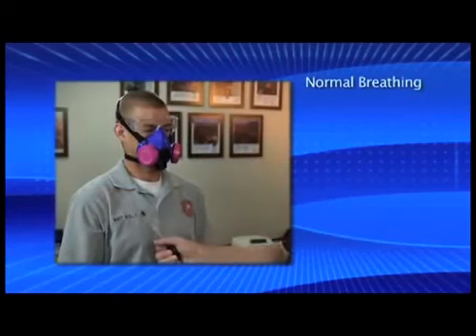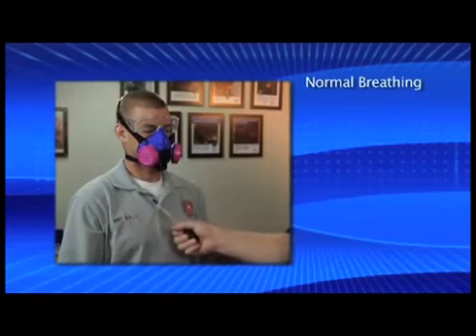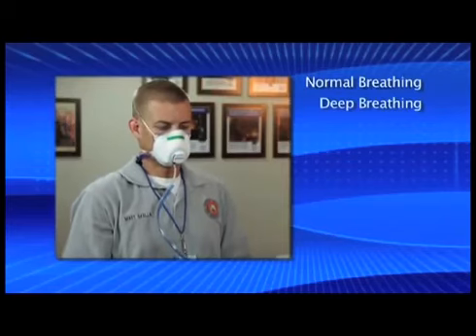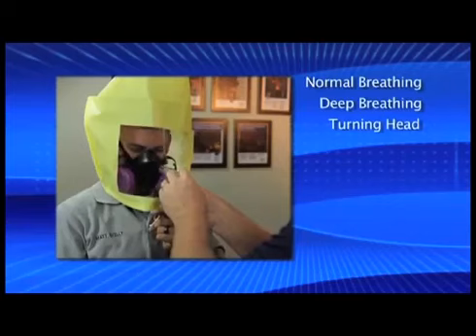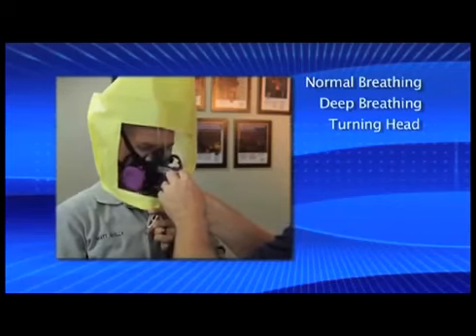Normal breathing. In a normal standing position, without talking, the subject breathes normally. Deep breathing. In a normal standing position, the subject breathes slowly and deeply, taking care not to hyperventilate. Turning head side to side. Standing in place, the subject slowly turns their head from side to side. Hold each extreme momentarily for the subject to inhale.